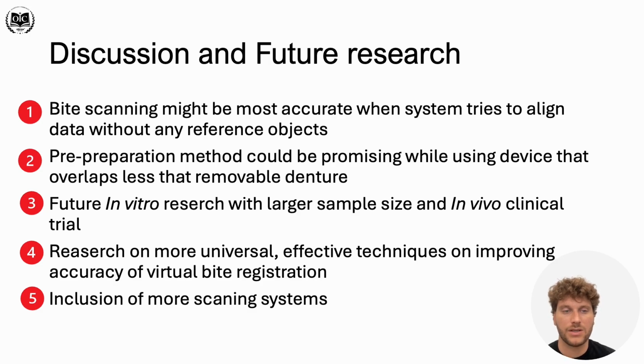And as I mentioned, bite registration is a topic that is not getting much attention in research on digital technologies and scanning. So in the future, more in vitro and also in vivo trials should be done to standardize and provide more information for clinicians on how reliable these technologies are.